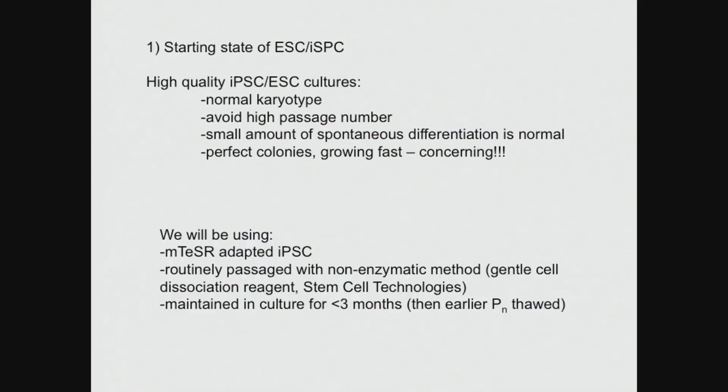We routinely passage these cells non-enzymatically. So for the cells you'll be working with later today, they've been passaged up until now with this gentle cell dissociation reagent from Stem Cell Technologies. Don't know what's in it, but I suspect it's just EDTA based. It's non-enzymatic.